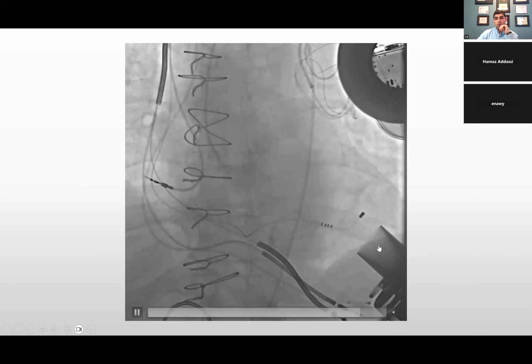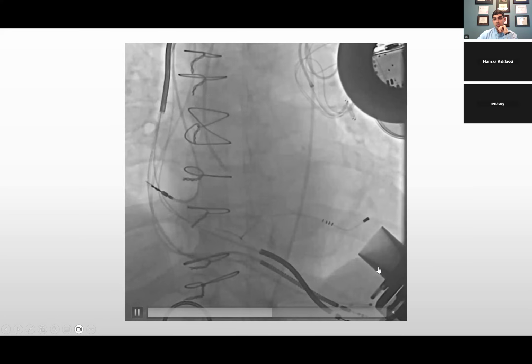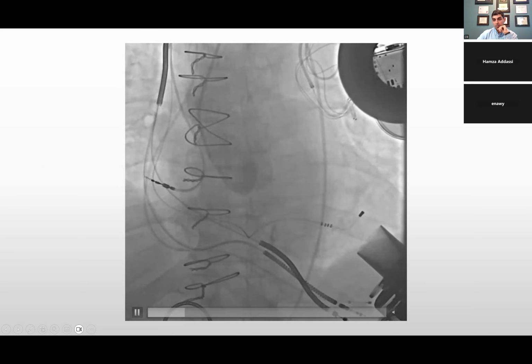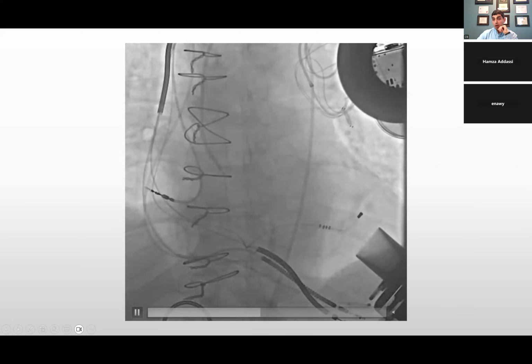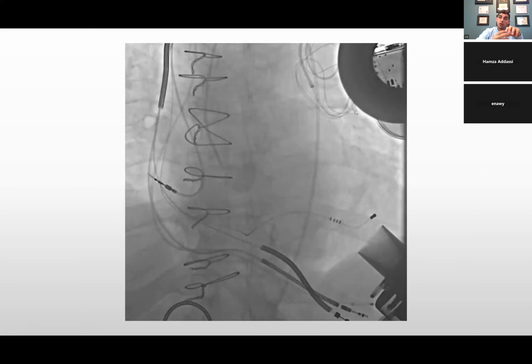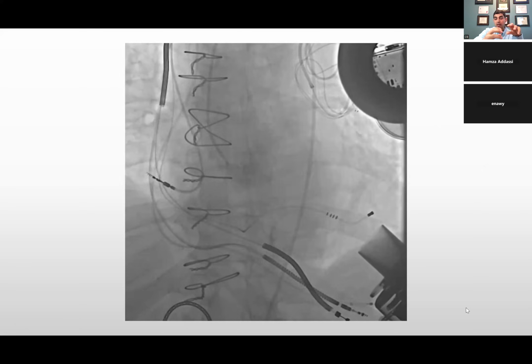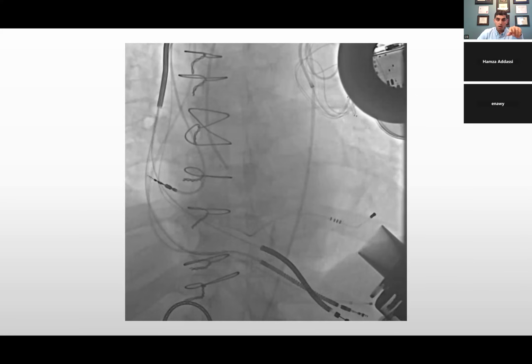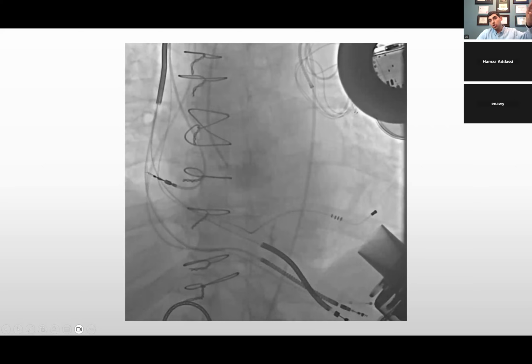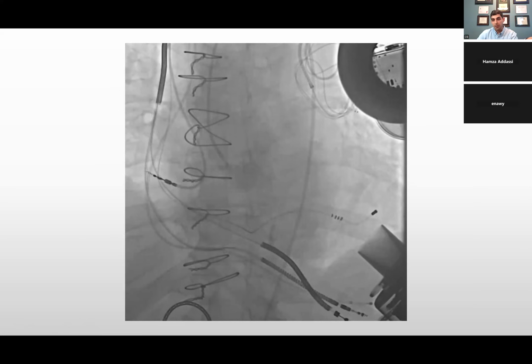So moving on. So we talked about if the valve is narrowed. So let's say, does anyone know what this is right here, where my mouse is? So this is called a HeartMate. So what's a HeartMate? A HeartMate is a pump. So the surgeon comes in, he cuts the apex of the heart out, he connects a pump inside, so the blood is taken from the LV into the pump, and then there's a tube that goes into the aorta and it shoots it into the aorta. And this is done in people with end-stage heart failure.